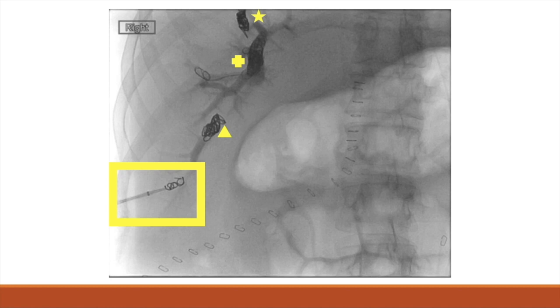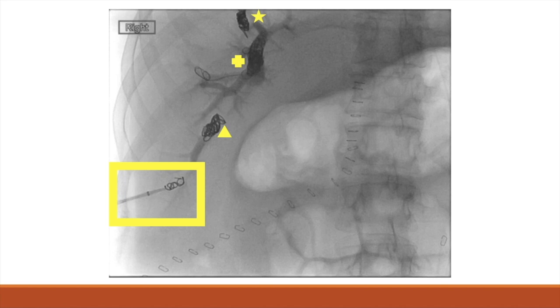Finally, as the catheter is being removed, the transhepatic tract is embolized to minimize the risk of bleeding. In the final image, the first tract embolized is represented by the star, the second by the plus, the third — the access portal vein — by the triangle, and in the square we can see coils in the transhepatic tract completing the embolization procedure.